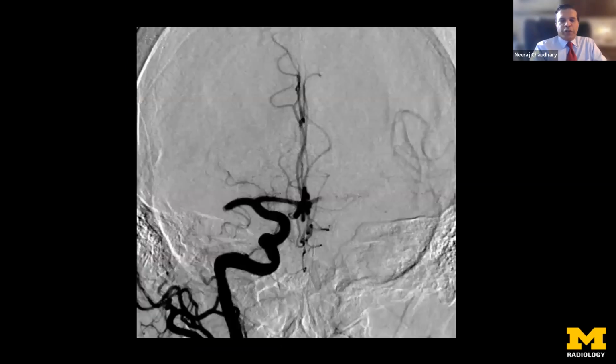So we'll move on to the angiogram. This patient, as we established, is a good candidate. And here we see the right-sided internal carotid artery angiogram. And as we saw, I see a terminus here. This is the middle cerebral artery coursing towards the lateral aspect of the right cerebral hemisphere. Dead stop. Doesn't go beyond the M1, M2 junction. There is complete lack of perfusion in that area.